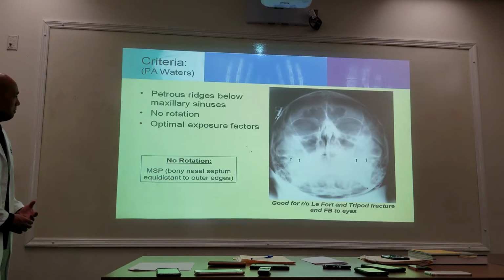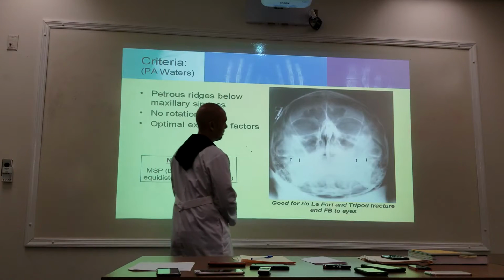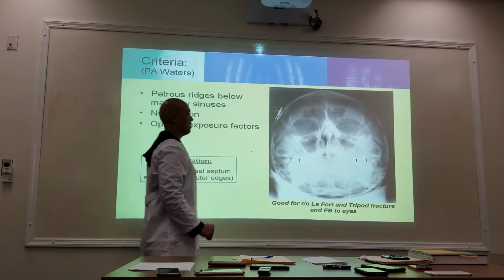Bony nasal septum with no rotation is equidistant on the outer edges. So can you guys see the bony nasal septum? Equidistant on both sides.